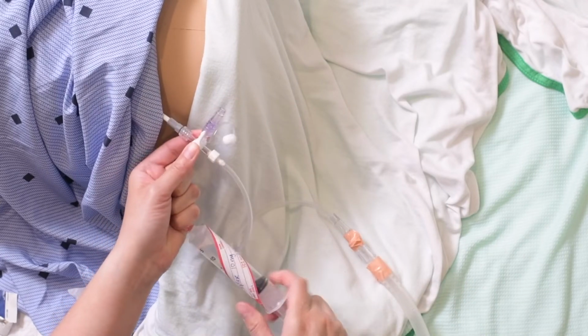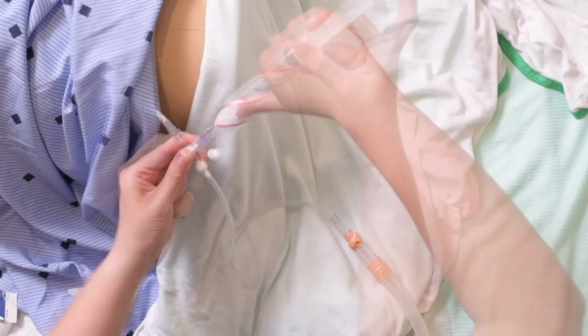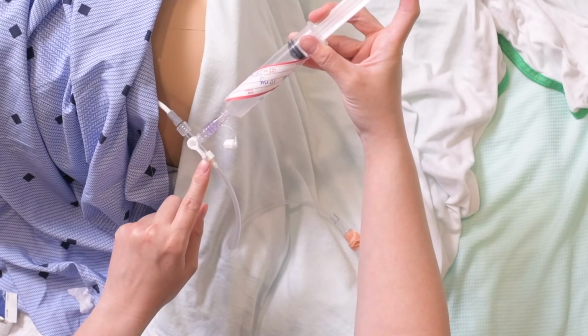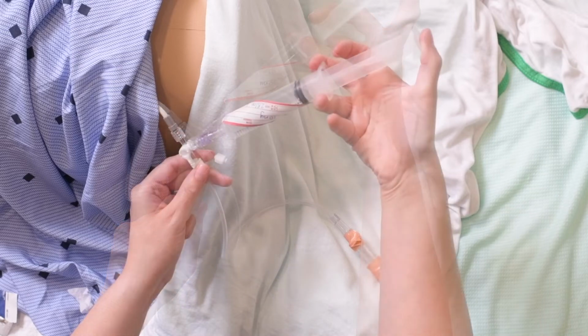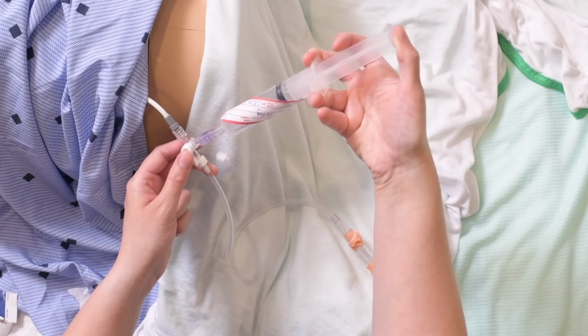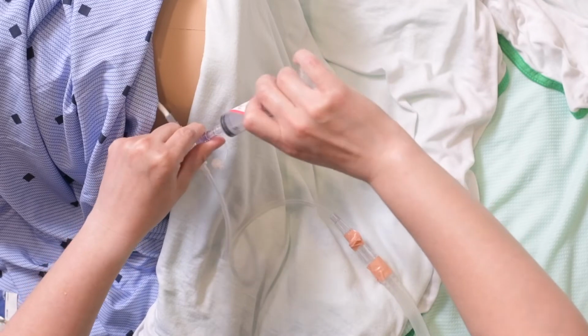Attach the syringe containing the Alteplase to the needle-free connector. Turn the valve of the three-way connector so the off is towards the drainage system. Allow the drug to go into the patient. Inject the Alteplase. Remove the empty syringe.